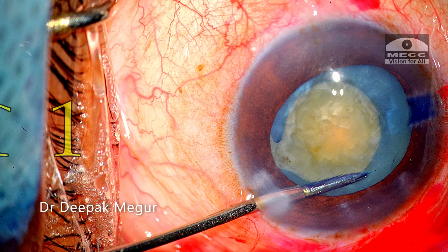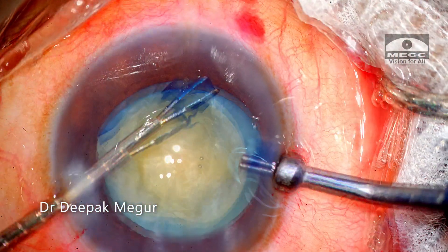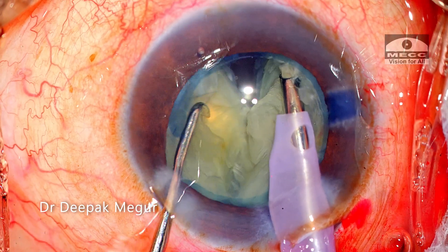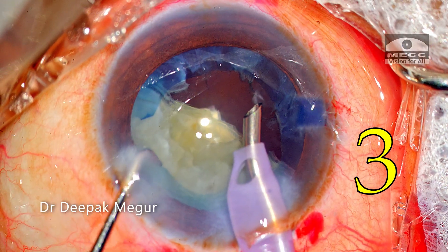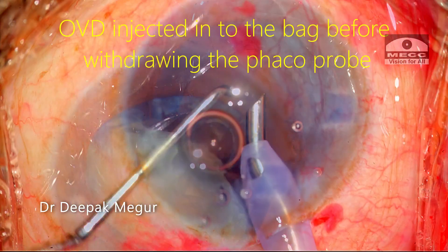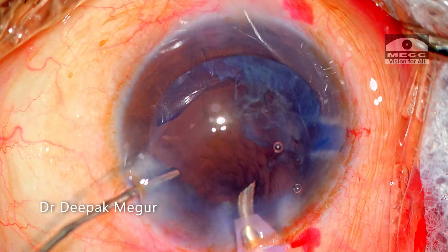If I decide to continue with phaco, here are the seven principles I follow. First, I always enlarge the other quadrant of the rhexis, especially if the capsular opening is very small to begin with — this ensures lesser stress on the bag during nucleus manipulation, particularly during division. Second, I avoid hydrodissection and minimize nucleus rotation in eyes with a discontinuous rhexis. Third, and most importantly, I ensure that chamber equilibrium is maintained at every moment, because sudden shallowing or deepening will extend the torn edge of the anterior capsule beyond the equator and into the posterior capsule.